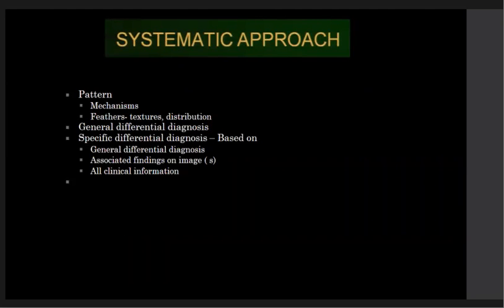In each pattern mentioned above, I will discuss the main pattern, mechanism of the pattern, features, texture and distribution, and general differential diagnosis and specific differential diagnosis based on the general differential diagnosis, associated findings on the images, and all the clinical information. So this lecture is very important to know the basics of the lung patterns we will discuss.